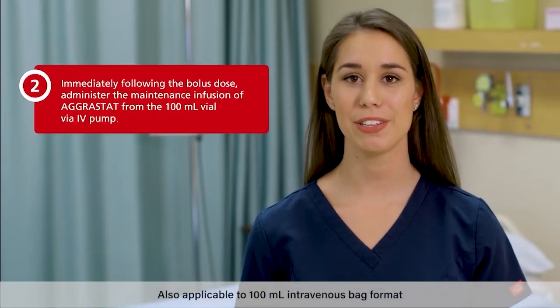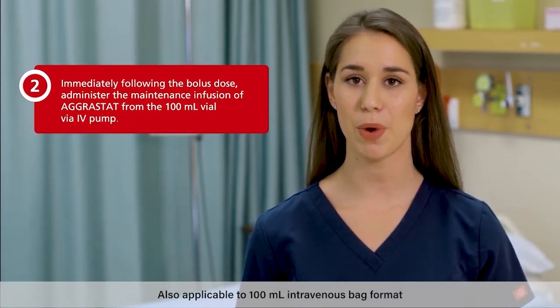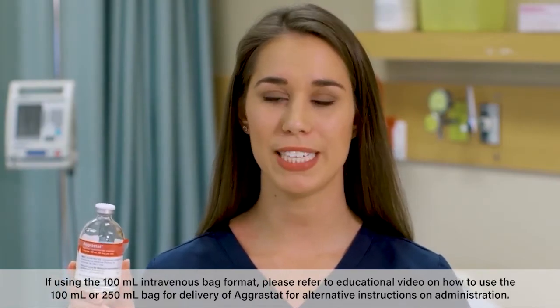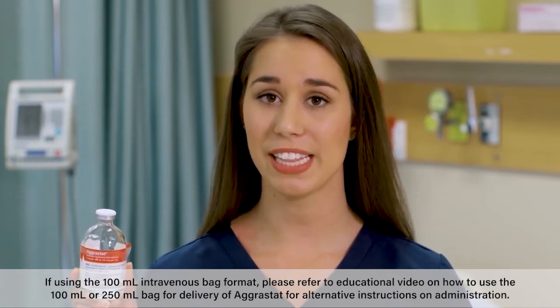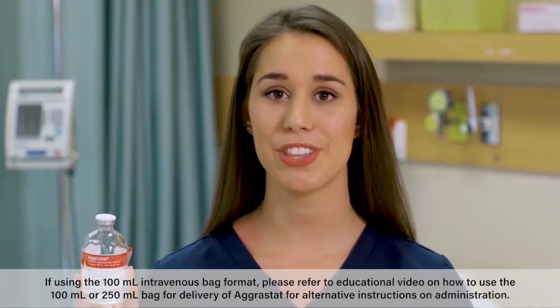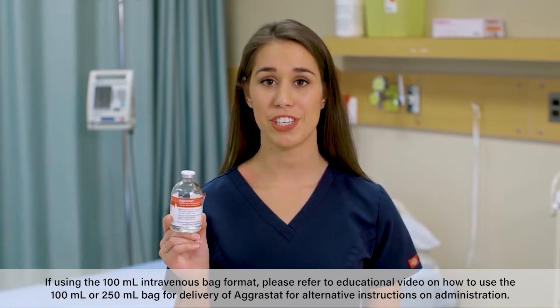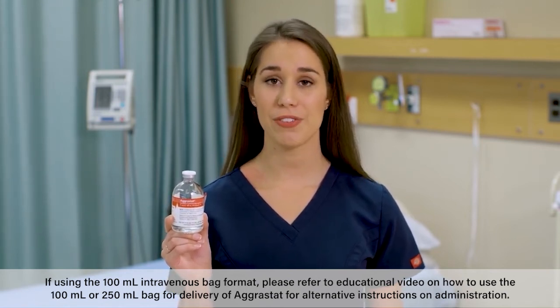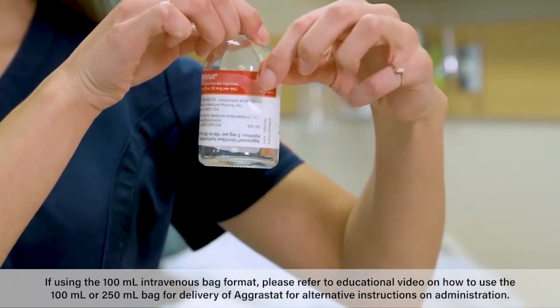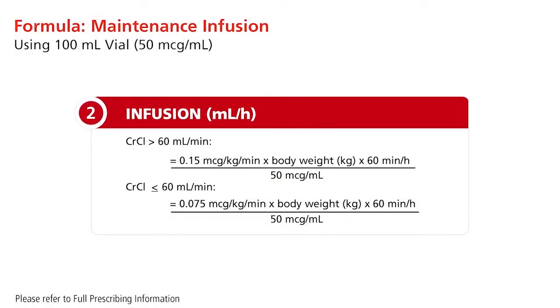Step 2. Administer the maintenance infusion. Immediately following the bolus dose, administer the maintenance infusion from the 100 milliliter vial by IV pump. To open, remove the vial from the light protective carton. Discard the product if there are any leaks or if sterility is suspect. The solution should be clear with no particulate matter. Ensure the seal is intact. Place the vial on a flat surface. Insert a vented administration kit into the vial. Alternatively, a universal set with the vent open can be used. Pull the plastic hanger from the vial label and invert to hang. The rate of the maintenance infusion can be calculated using the following formula.